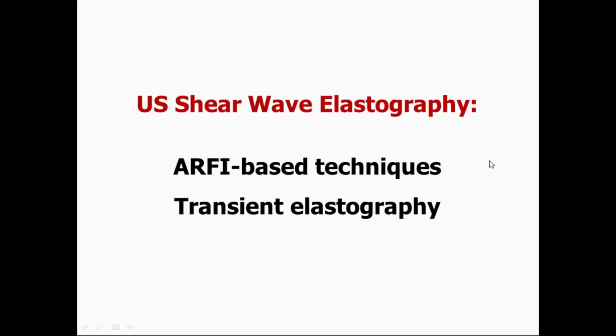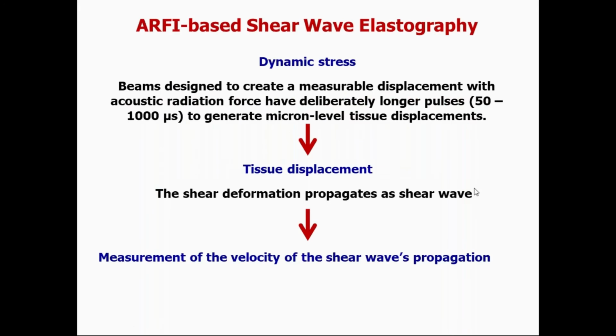The ultrasound shear wave elastography techniques are either ARFI-based, or we have the FibroScan, the transient elastography.